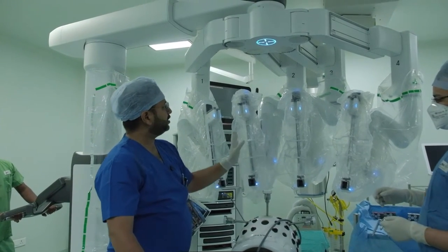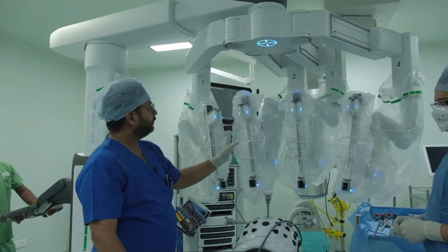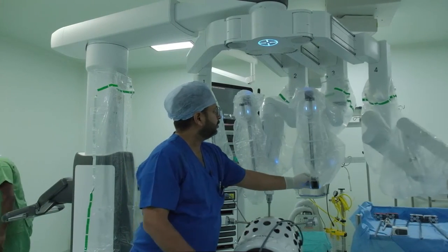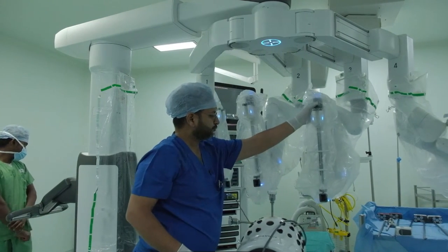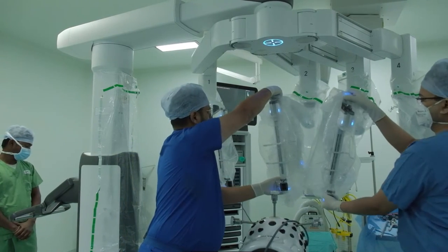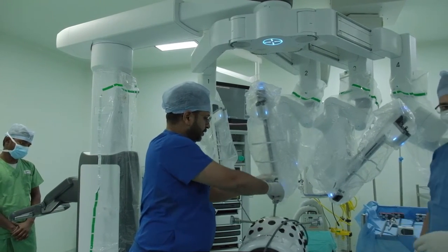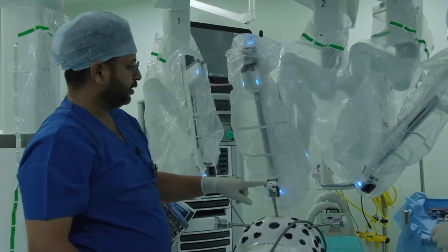So any of these arms can be used for the camera. We'll use arm 2. So Dr. Tushar can just pull this apart. So we are not going to use arm 4 for now. We are going to use arm 3 and arm 2. And first we dock the camera port. So this is the docking mechanism wherein we press this button and the arm is docked.